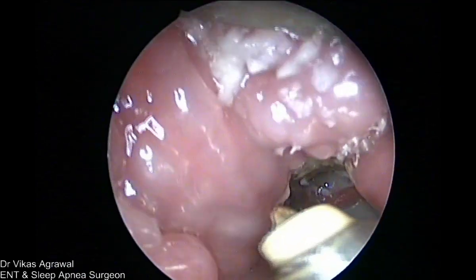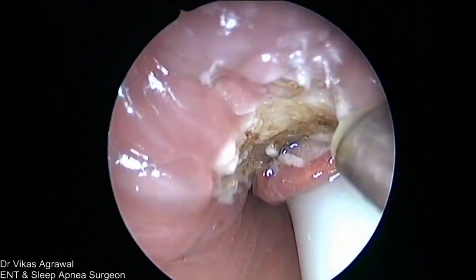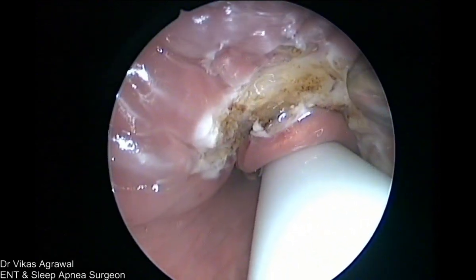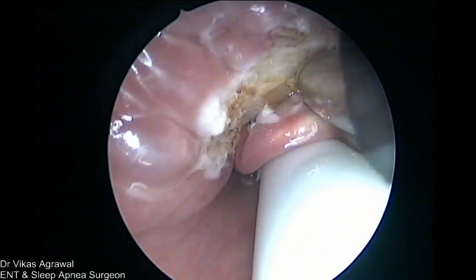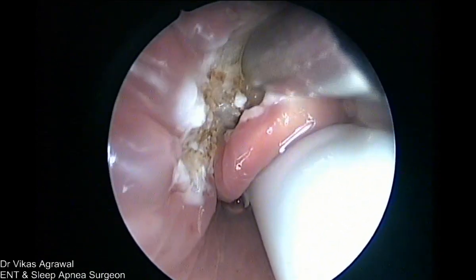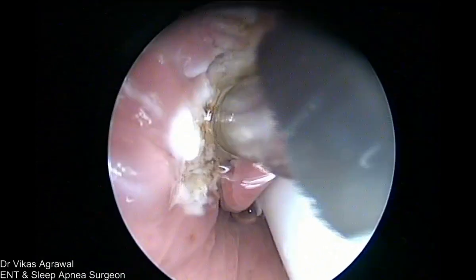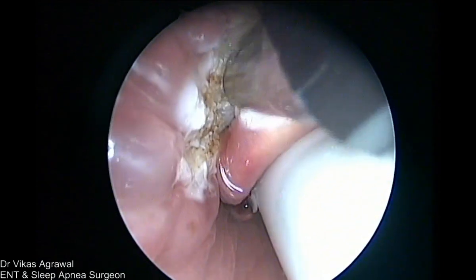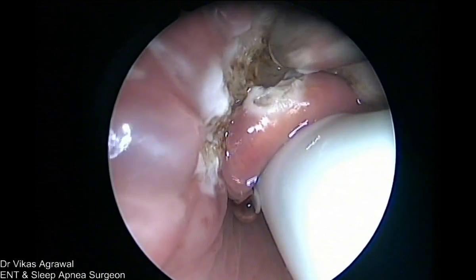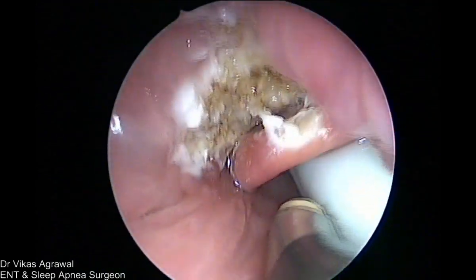See, there is no point removing all this. This is not causing any problem. At the most, if you want, you can just coagulate this and leave it. Even if you have to remove more, it's the midline which is the problem. So I am going into the muscles of the midline and removing a little more into the midline. Because if we are able to keep the midline open, that's more than enough.